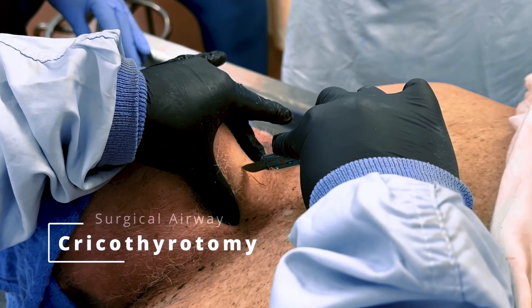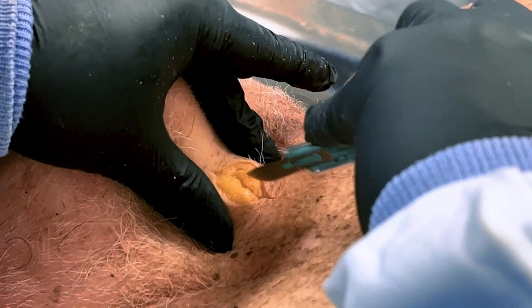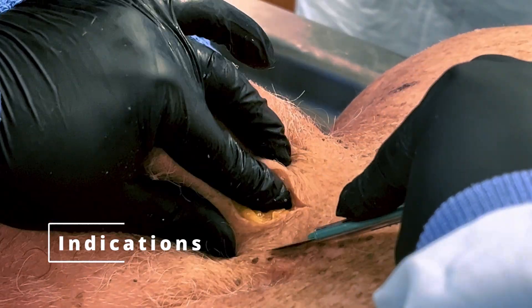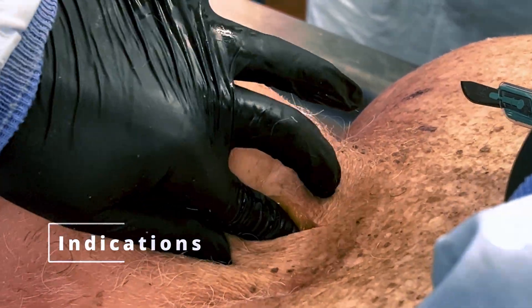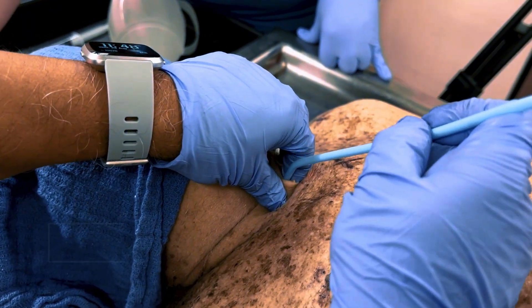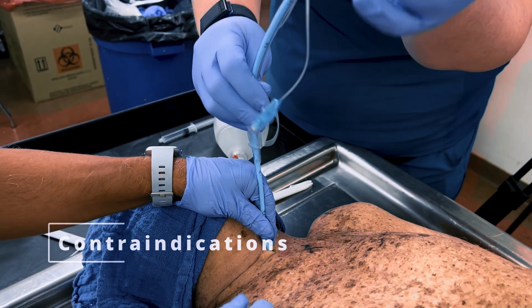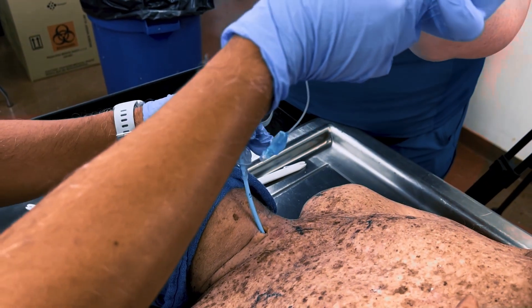Hello and welcome to our surgical airway demonstration video. We will be going through the procedure for establishing a surgical cricothyrotomy. This technique is indicated in cases of life-threatening airway compromise when all other airway interventions have failed or as directed by the difficult airway guidelines. It's important to note that this procedure is contraindicated for patients under 10 years of age or when an airway can be obtained by any other means.